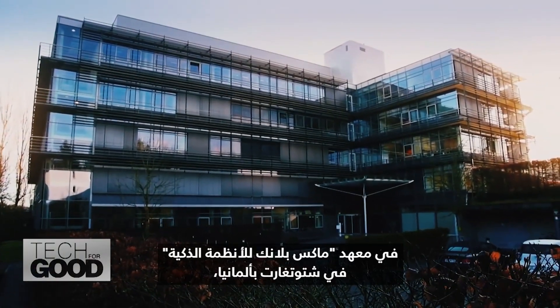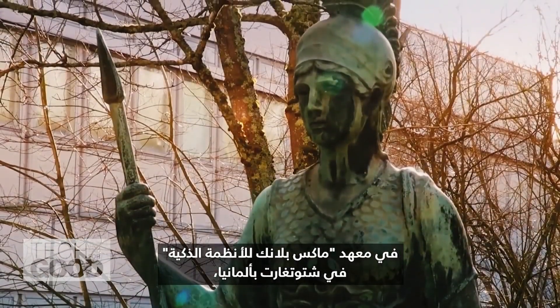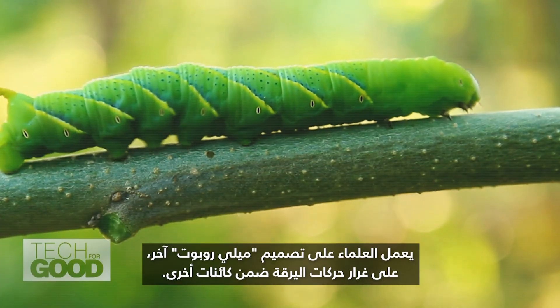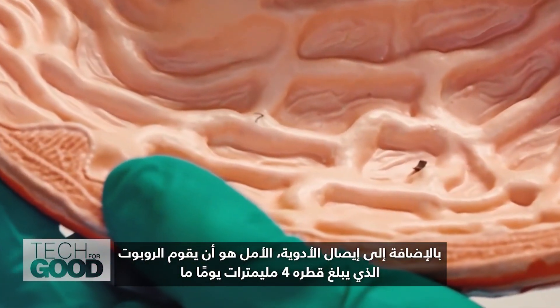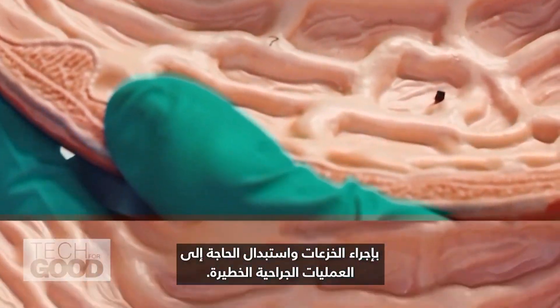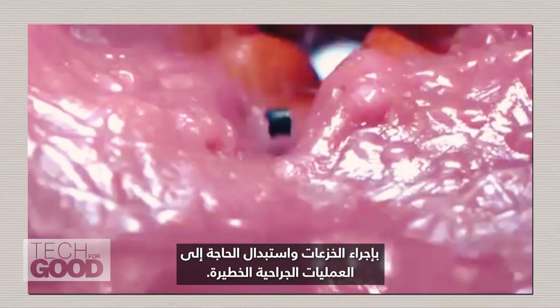At the Max Planck Institute for Intelligent Systems in Stuttgart, Germany, scientists are working on another milli robot design modeled after the movements of a caterpillar among other organisms. In addition to drug delivery, the hope is to someday have the four-millimeter robot perform biopsies and replace the need for invasive surgeries.